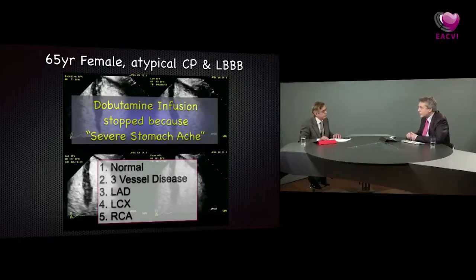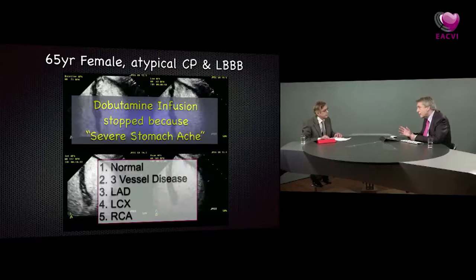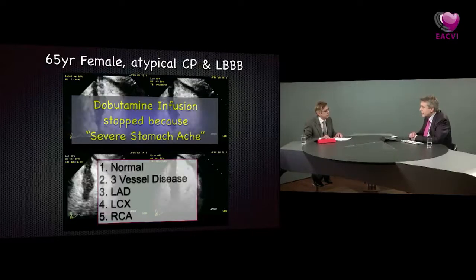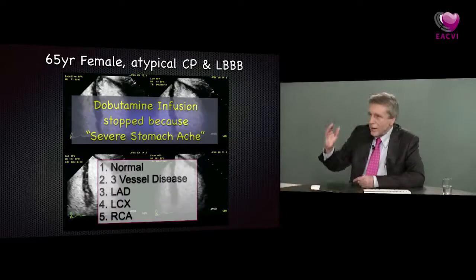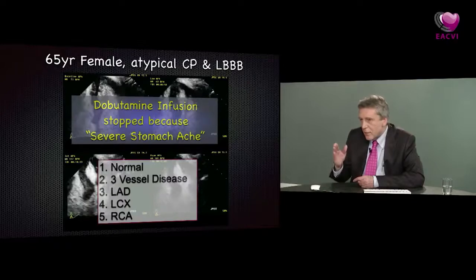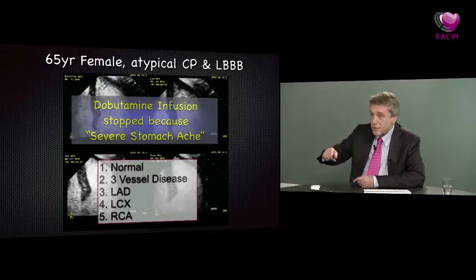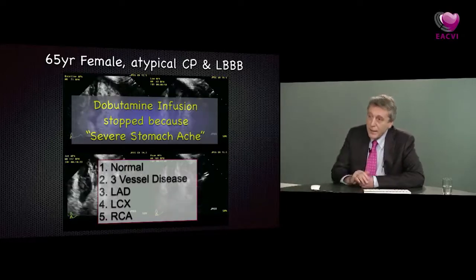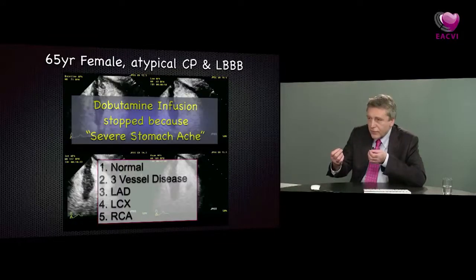Yes. And also you need to make sure there isn't any shadowing. Shadowing can occur from ribs, and it can occur from even things like papillary muscles. It can run along the myocardium and make it look like a perfusion defect. One of the ways of determining whether it's truly a shadow or a true perfusion defect is that if it's a shadow, it'll have a linear edge to it. It'll run in a straight line. So adjusting the gain, adjusting the contrast, adjusting the focus.